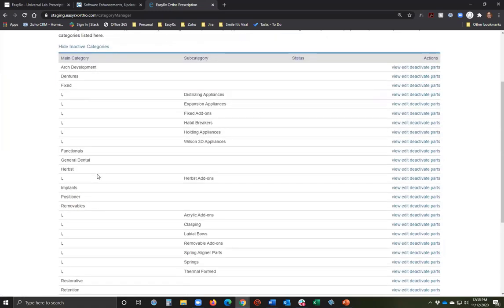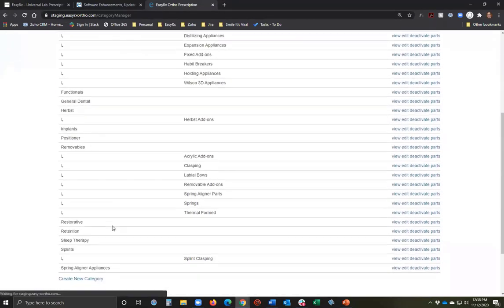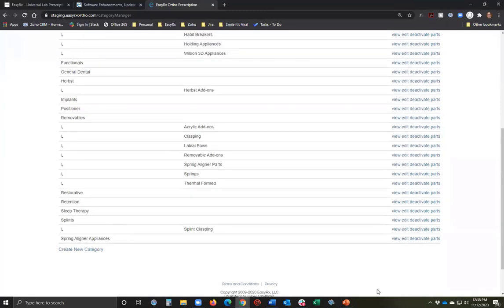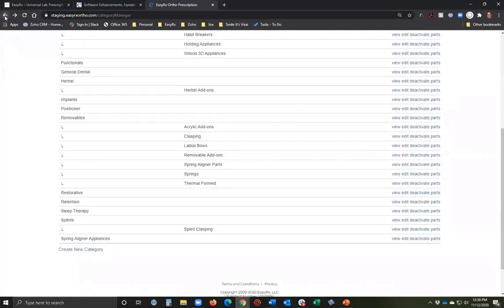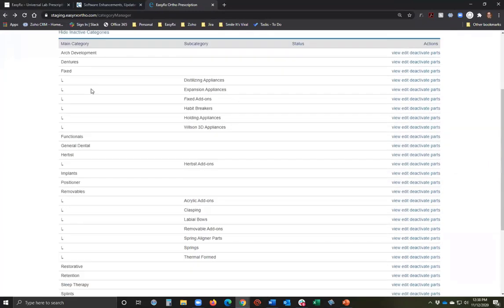You can also go to 'Category Manager,' which lets you quickly review all categories. If there are certain categories you don't want available, you can deactivate an entire category. Click 'Parts' to see all parts in that category. So as a tip: whenever we push out a release, check for new parts. You can hide them, give them a different name, or even change the category.